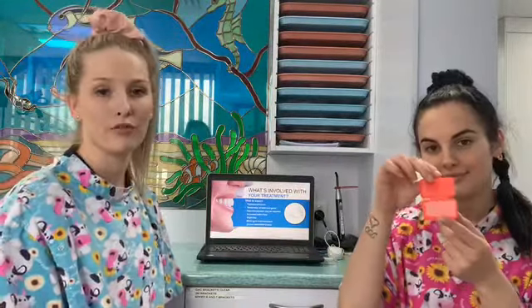And sometimes we can get minor gum irritations and ulcers. It is very rare for people wearing aligners, but all we need to do is, if it feels like your attachment or your aligner is rubbing, break a little bit of wax off, and all you have to do is roll it into a ball and place it over the top of the attachment or the aligner that feels like it's rubbing.